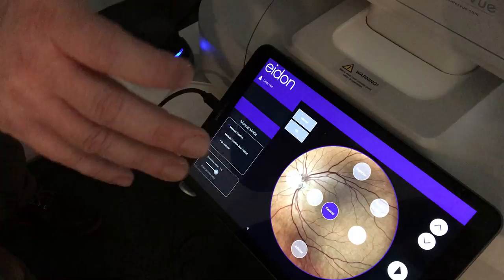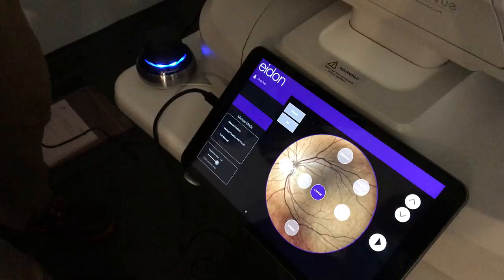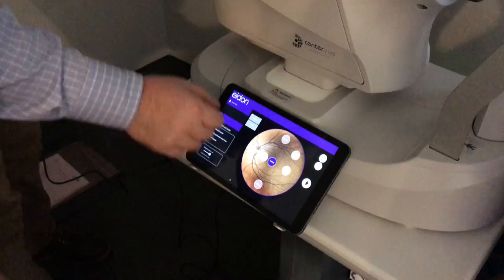Switch over to manual. Now it's going to give me the choice of right or left eye, so we're going to do right eye. I'm going to do manual fixation — that's going to allow me to hijack that fixation light and take it where I want it. But it is going to autofocus a little bit and get me in the ballpark.